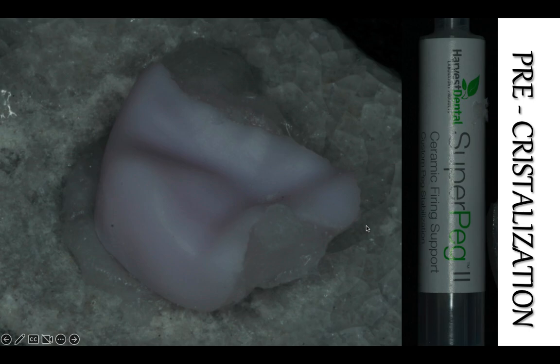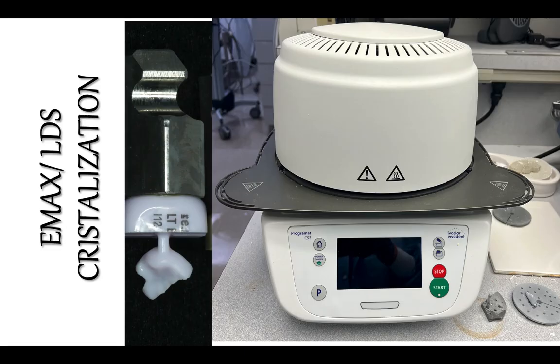After we do this, we normally place it in a sprue if it's a crown, but if it's an onlay, most likely the sprue will not hold it. So you just have to place it at the metal base plate. You will see all of this in aesthetic clinic when you come. And you have the plates, and the pins are these ones. So you put a pin in the intaglio, and then you put the pin on the plate, and then you place this one inside of the firing machine, and that's it.